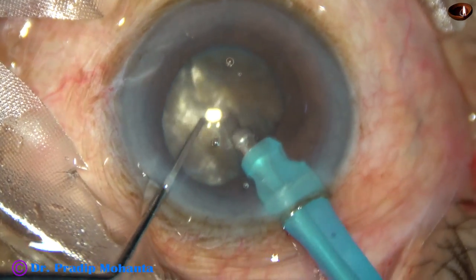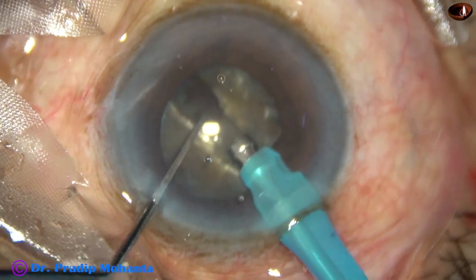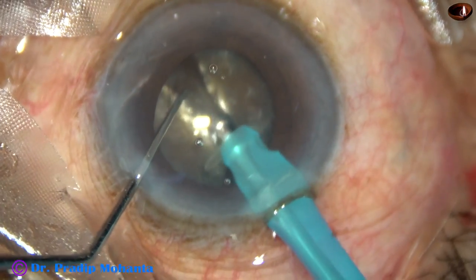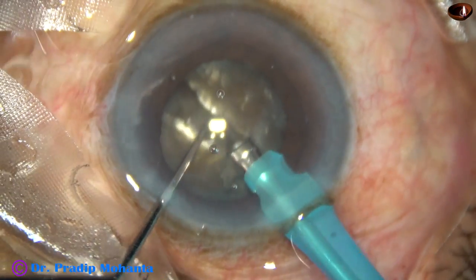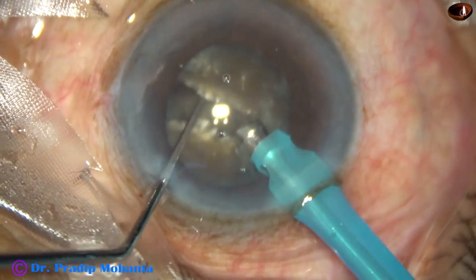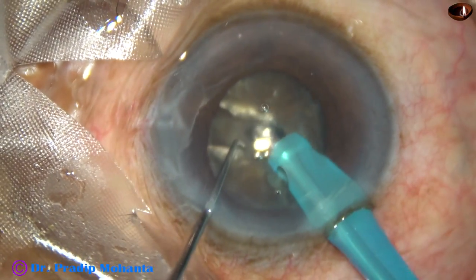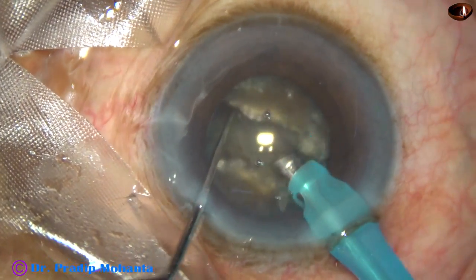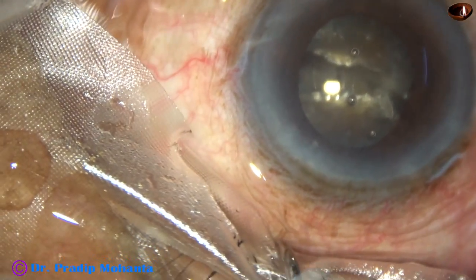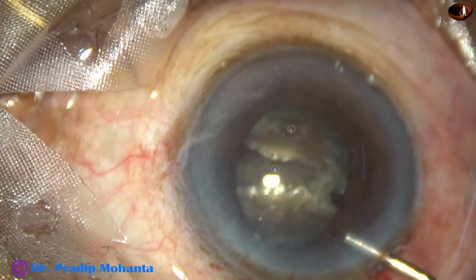And now, see what happens. Suddenly the pupillary margin just below the main incision got sucked into the aspirating port of the phaco needle, and the pupil is becoming small. One more complication: intraoperative miosis. The pupil has become very small — about 4 mm — and I don't want to continue without using a pupil expansion device.